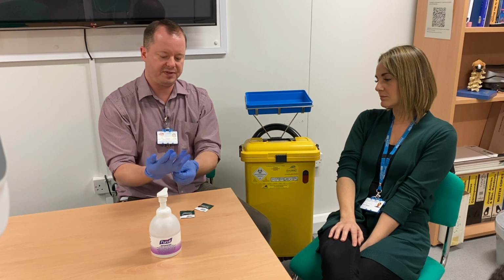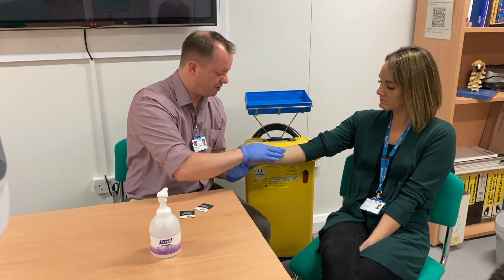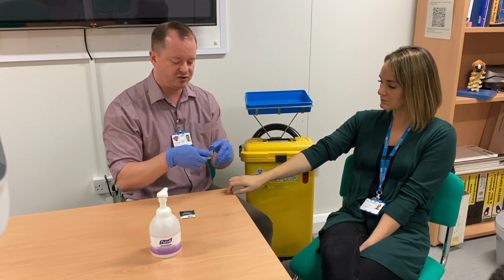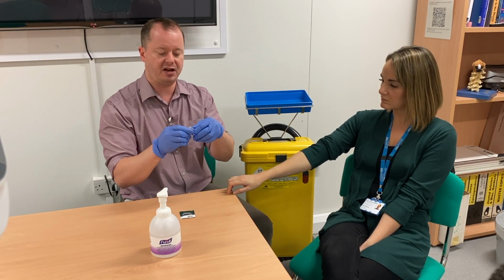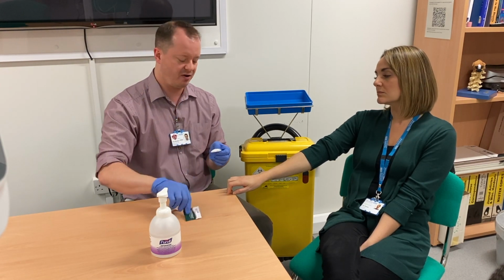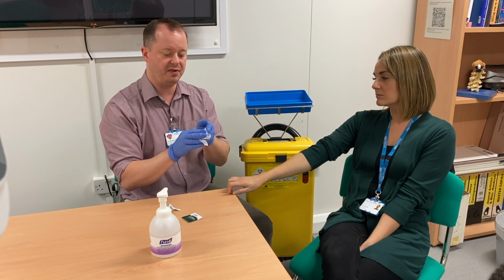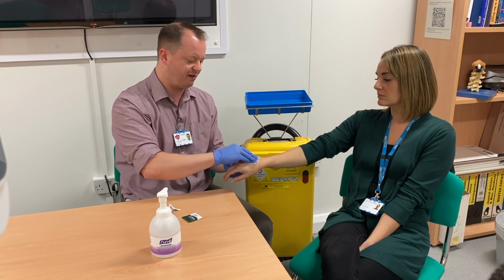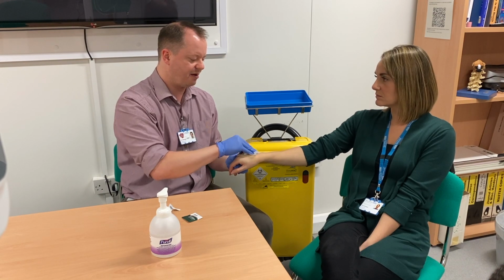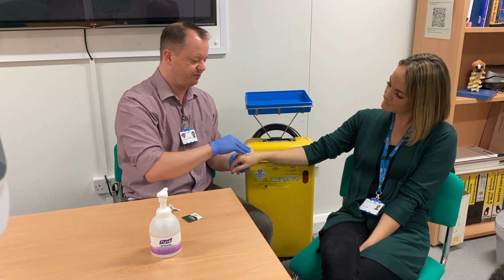If we are going to perform this skill, we need to look at the person's skin, try and find where we're going to be putting in the vein, and wherever we've decided to do that, we need to make sure that we clean the skin with 2% chlorhexidine. We use these 2% chlorhexidine Clinell wipes. If you are going to clean the skin, we recommend that you use the entire wipe, lots of different areas of the wipe, and you clean the skin for 30 seconds, in multiple different directions, making sure that you've cleaned a really good area.